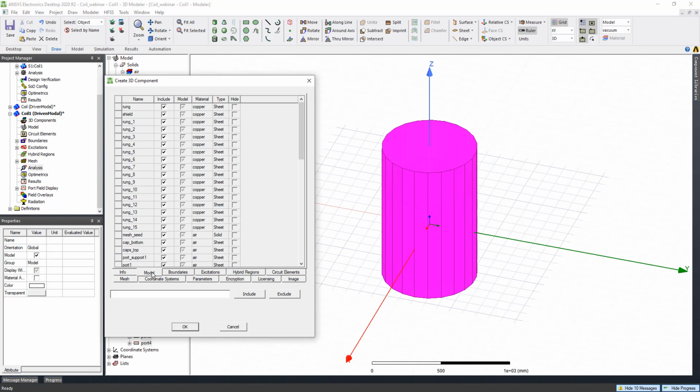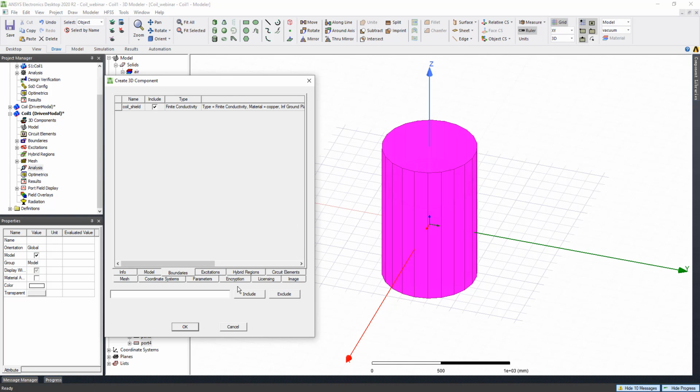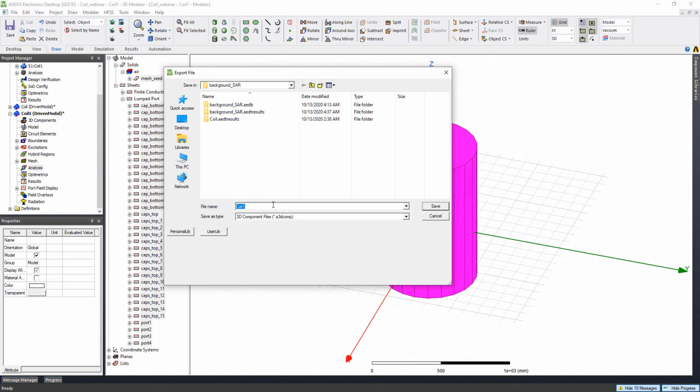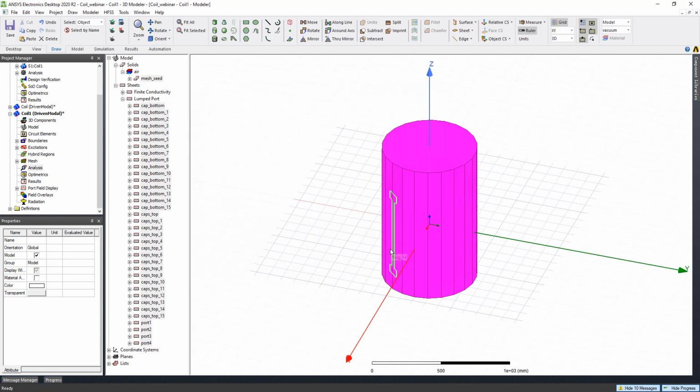So here from info we can look at everything that is included in the selected components: the boundary, the excitations, circuit elements. We have the mesh setup, the coordinate system, and so on. So you just need to click OK and then save it as a 3D component file. I can just save it as MRI coil. Save. Okay.